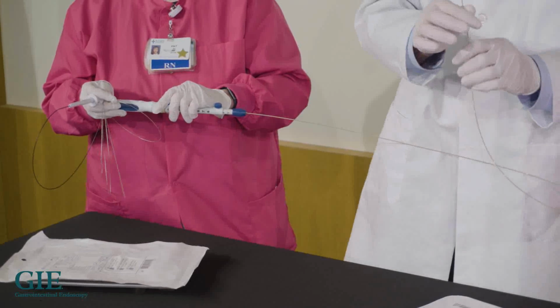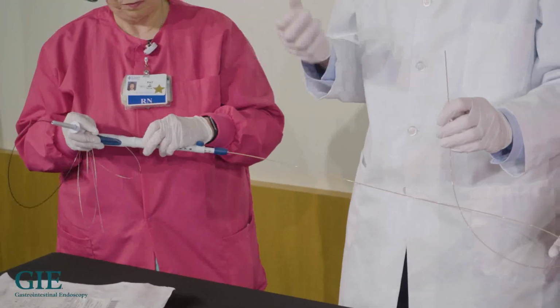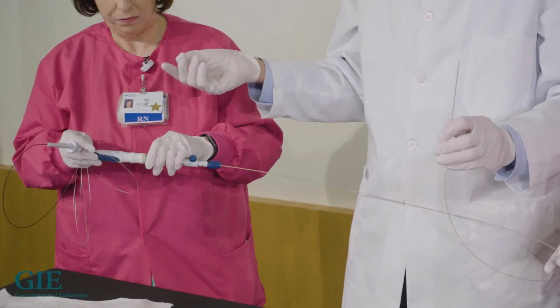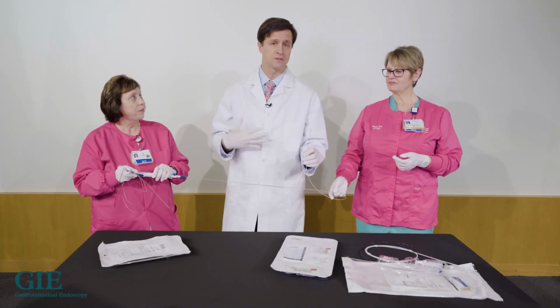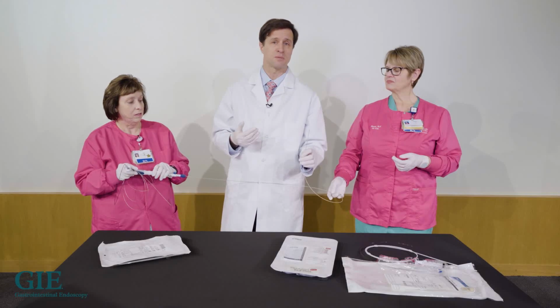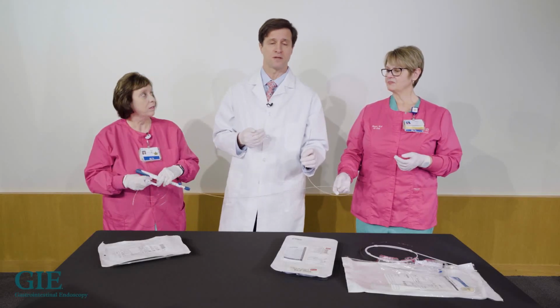Now, once it's in, we don't actually have to remove the needle from the cystic lesion. So if you want more tissue, which pathologists always want more tissue, and so do we, you can simply put the forceps back through again and get more tissue, however much you need. The more you sample the sidewall of a cyst or the lesion, the more you scrape it, the higher your risk of pancreatitis, and it is more than the standard risk of pancreatitis of less than 1% with the US FNA. So in summary, using the through the needle forceps with this is very straightforward.